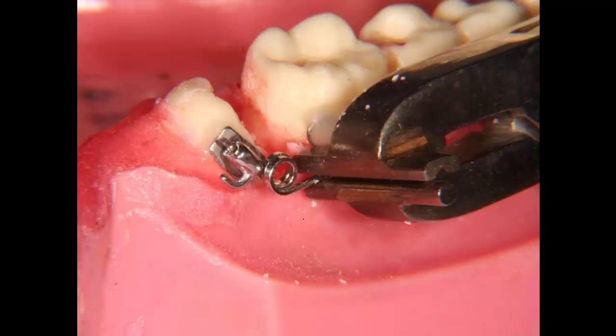So we reach in on the right side of the mouth, put that plier on this wire, and clamp it. You don't have to clamp it too much. If you clamp it real hard, you'd put 50, 60 degrees of bend in it, or maybe even more than that. So you put usually about 30 degrees, and that'll be what you have. You'll have a few degrees of operation when you activate it. So if you put about a 30-degree bend in it, it'll be plenty of force to pick this tooth up and bring it back.